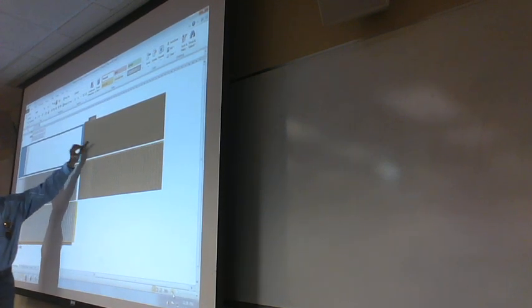And so it's going to basically bounce between here, here, here, and here. So basically take the average. You have to then normalize that to the minimum and maximum that's calculated for each channel for each subject. And it comes down to this, the other part that matters. I said there's two things that matter. You paste it in here.